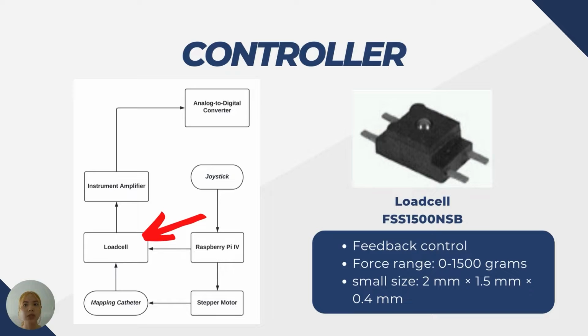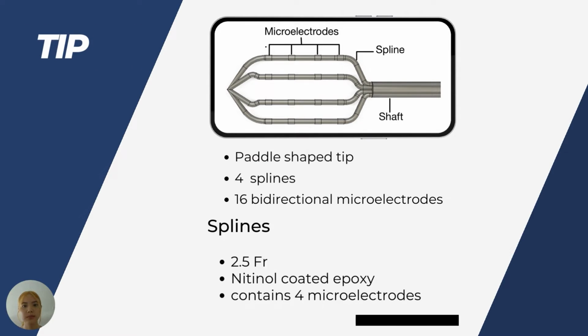Then, the load cell functions to give feedback control. It monitors force within the pull wires. The data from the load cell will be amplified and converted to digital before being analyzed in the microcontroller. Next, the tip.